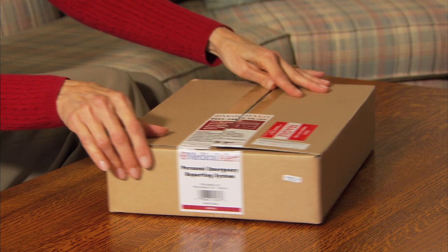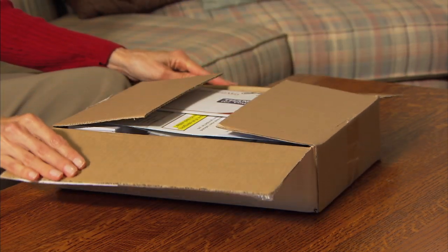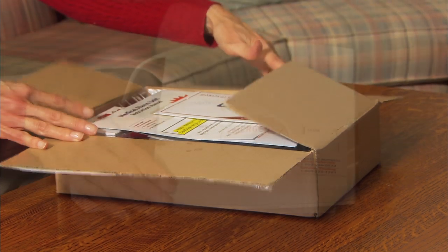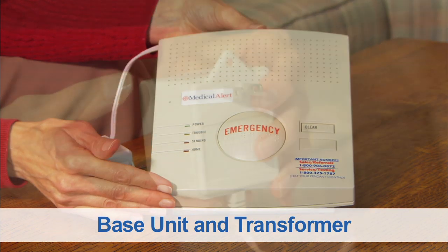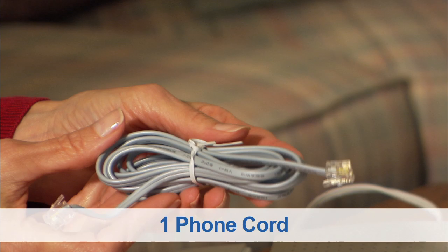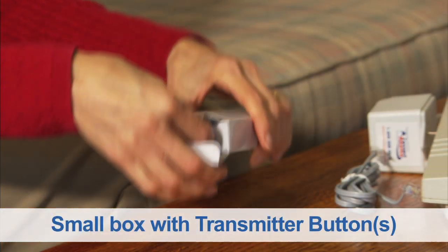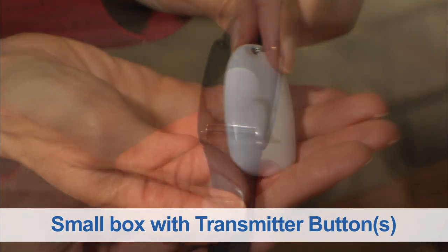Please have the box you received from Medical Alert in front of you. Your package from Medical Alert will include the following items: a base unit with power transformer attached, one phone cord, and a small box that includes your emergency button wristband and pendant.